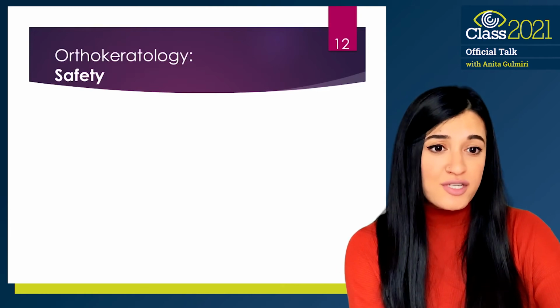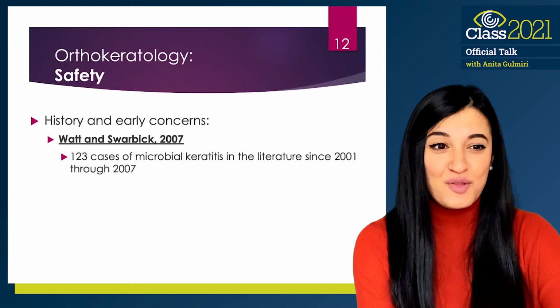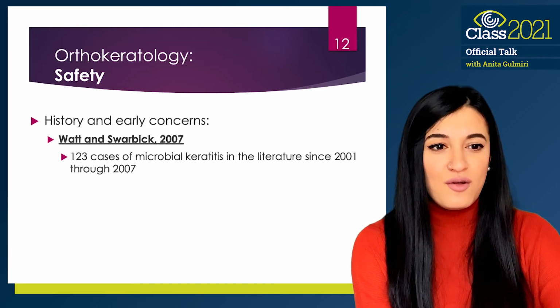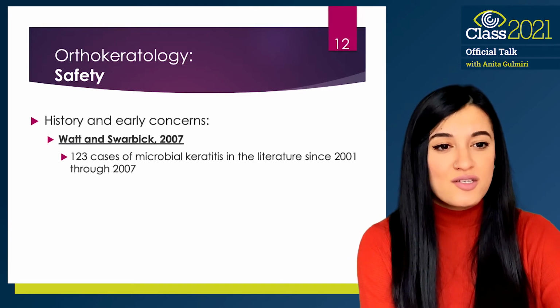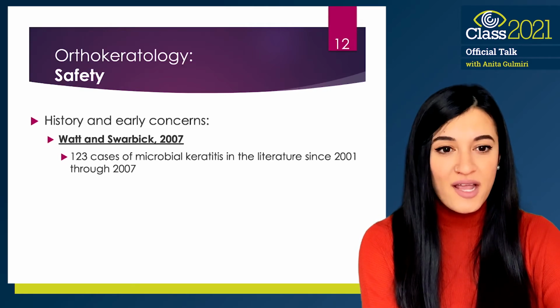Another topic of interest with ortho-K has been its safety, and you may have had discussions with your colleagues on the topic of this as well. And if you look at the history, that might have been for good reason, because in the early 2000s, there was this surge of independent case reports of orthokeratology and microbial keratitis.